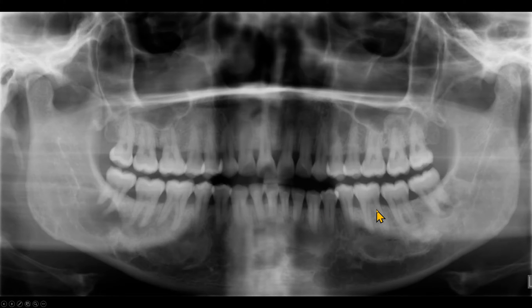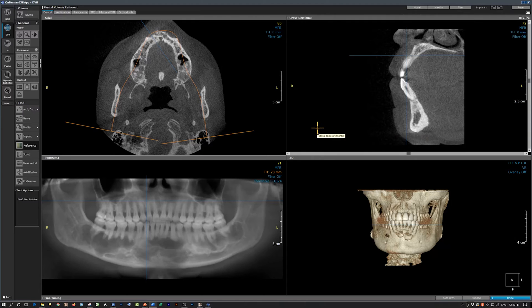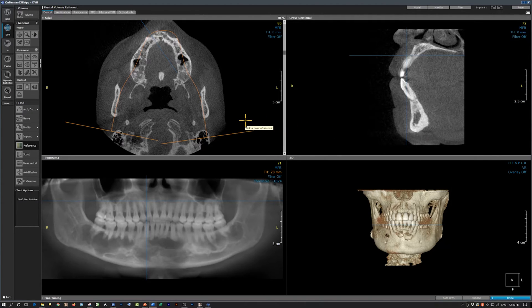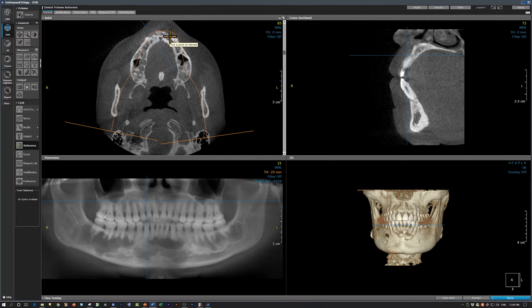Let's review the findings on a CBCT scan. We are using On-Demand 3D to review the scan. Starting from the axial slices at the level of the maxillary molar apices, in the maxillary molar regions bilaterally you can see irregular radio-opacities, which we will review in cross-sections. There is also some expansion visible in the maxillary incisor apical region.